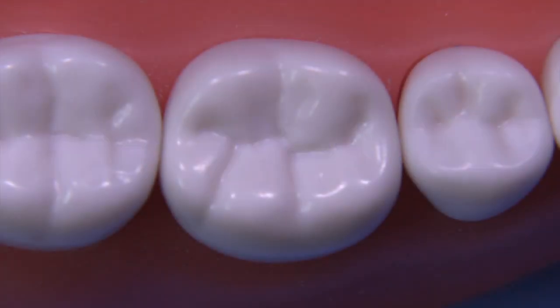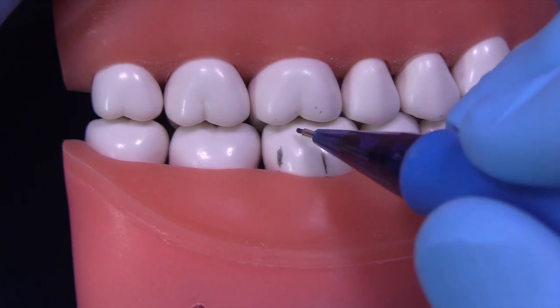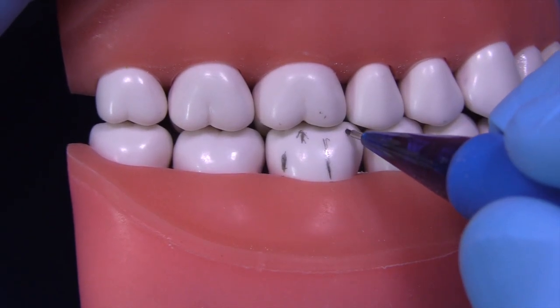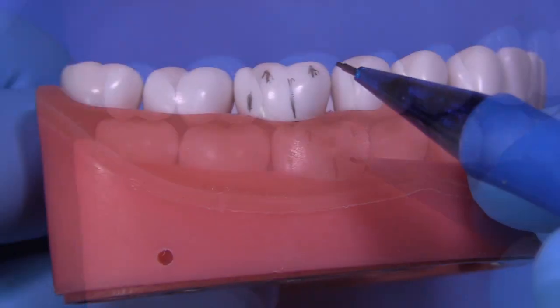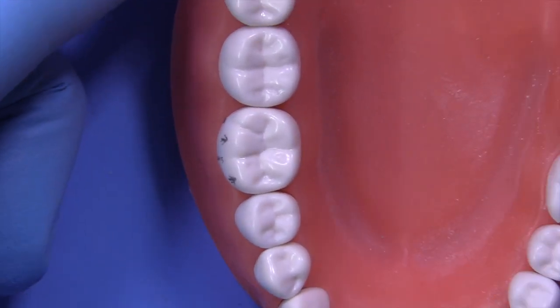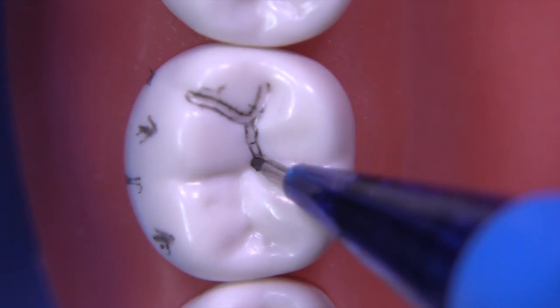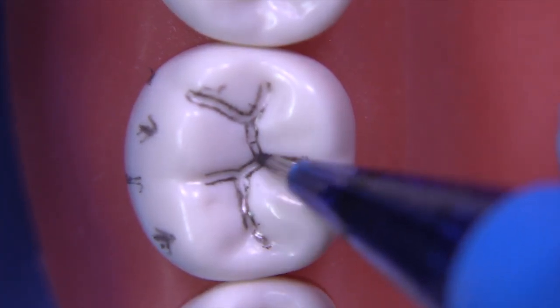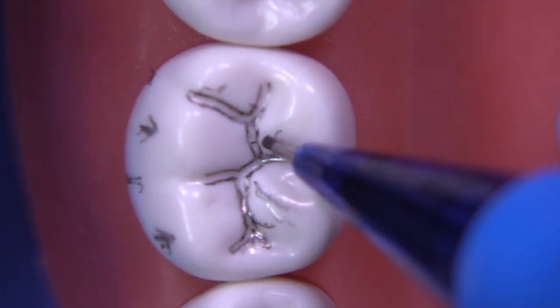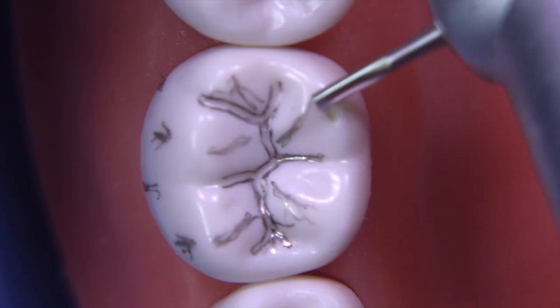Let's take a look at the tooth and make some decisions about where we want to put things. We're going to look at it from the side in occlusion, and I like to make a few marks on the side of the tooth to orient me on where I want the low points and high points of my reduction as viewed from the facial. From the occlusal, pay attention to the morphology — the facial cusps have more of a flatter triangular ridge, while the lingual cusps have a more pronounced triangular ridge, and we want to follow that morphological variation when we prepare.